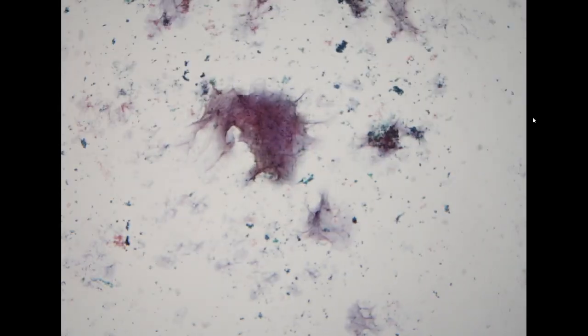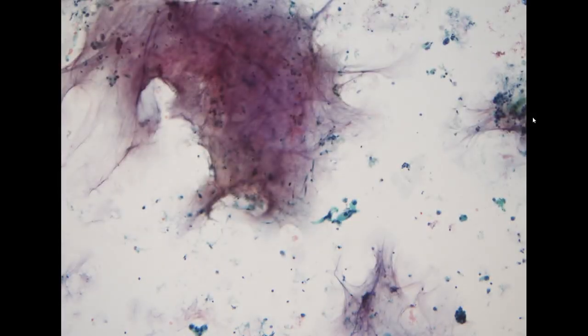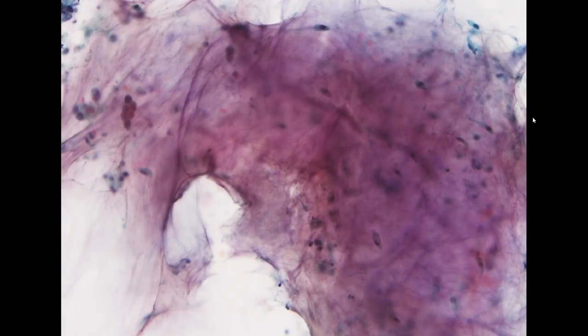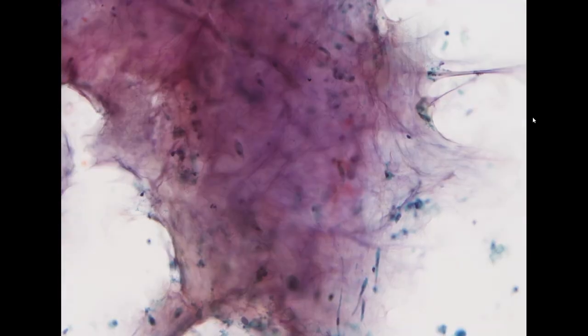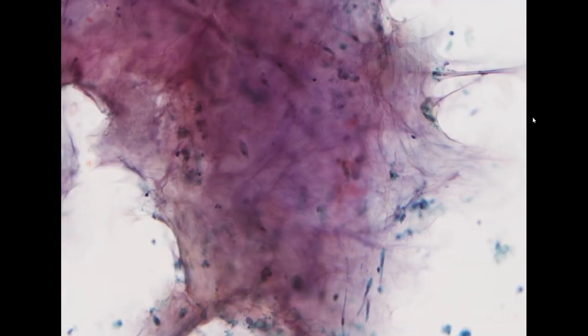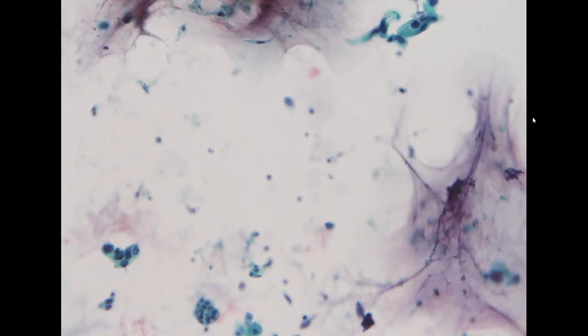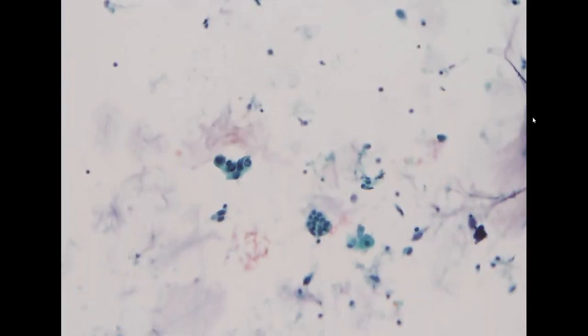So the next specimen, in the background you see a lot of mucin. So these findings are not normal. It's usually in a mucin-producing epithelial tumor. It can be IPMN, or it can be IPMN associated with adenocarcinoma.